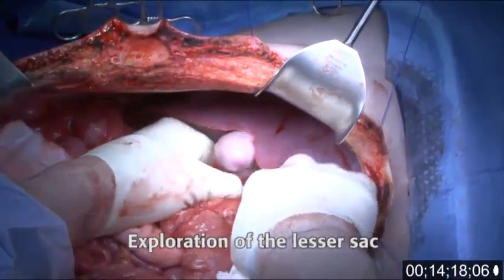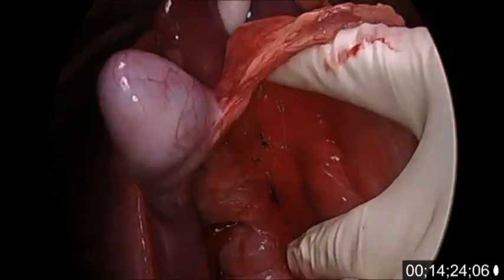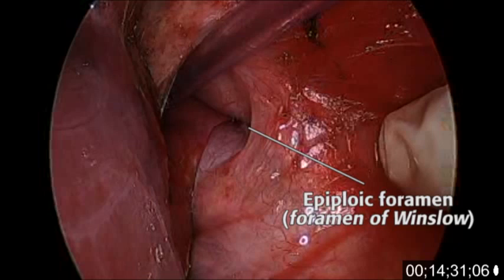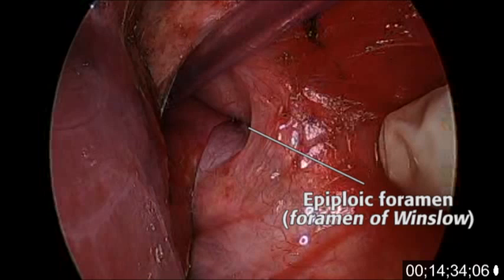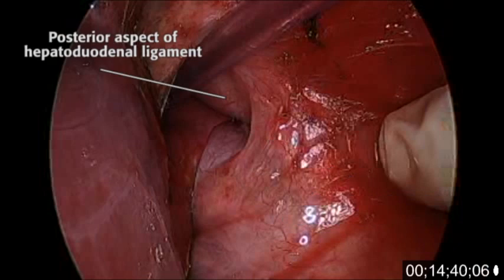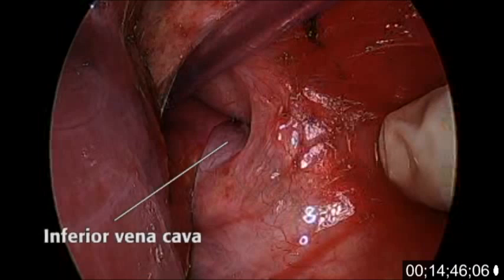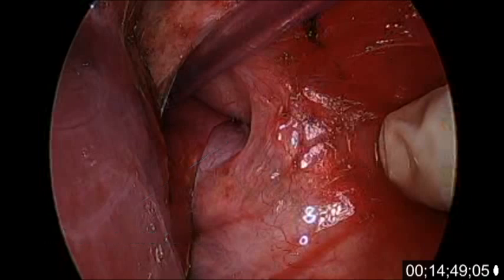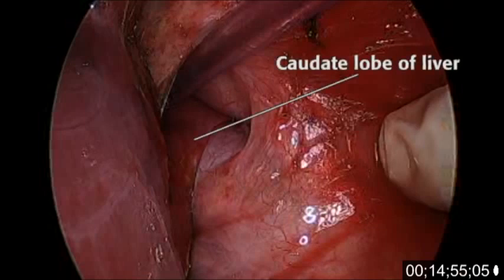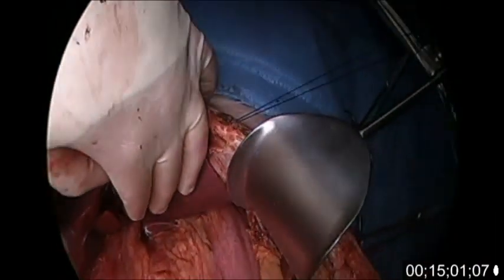After a complete abdominal and pelvic exploration, the lesser sac must be inspected and its surfaces visualized. The first maneuver is to explore the epiploic foramen, or foramen of Winslow, with the plastic suction tip. The posterior aspect of the hepatoduodenal ligament is inspected. In patients with peritoneal metastases, it is important to visualize an unnamed crevice or fissure created by the shelf of liver at the junction of the right and left caudate lobes. The lesser omentum is a part of the ventral mesentery that does not resorb.